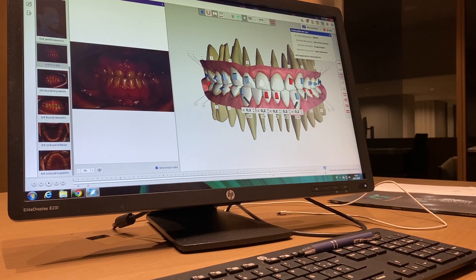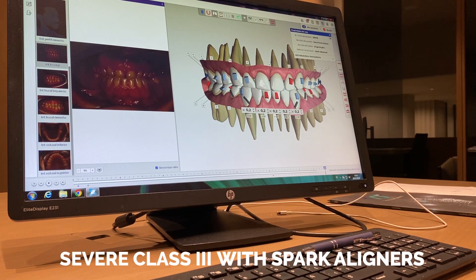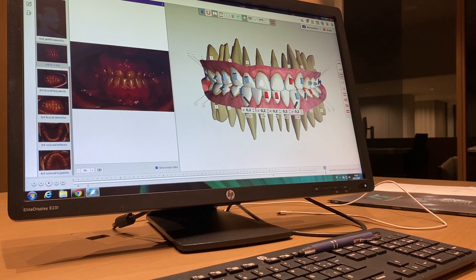Good morning everybody. I want to show you something I'm doing now with Spark aligners — I want to show you the way I'm going to solve a severe Class 3 with elastics. Maybe I will add screws later, but that's not in my current plan.